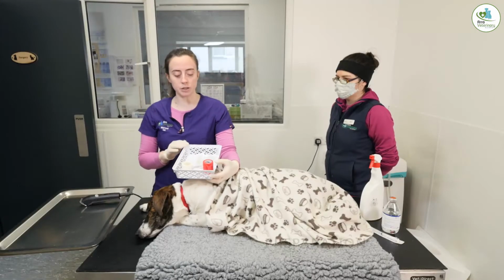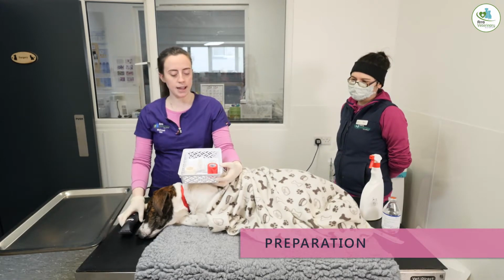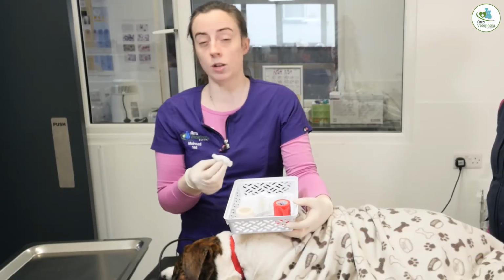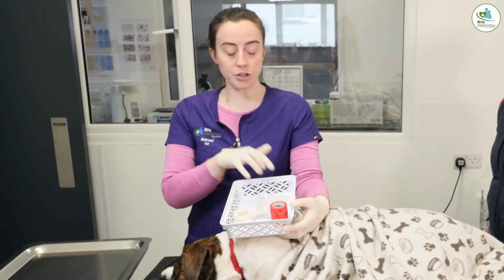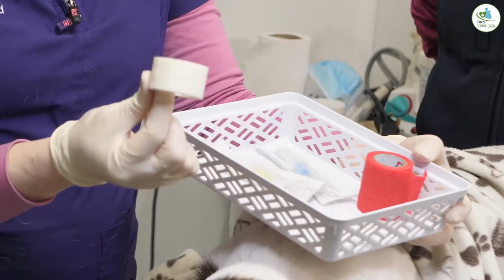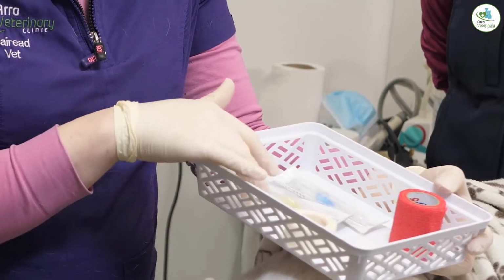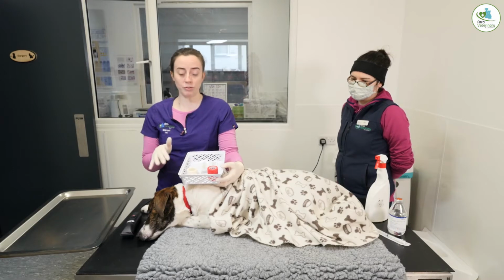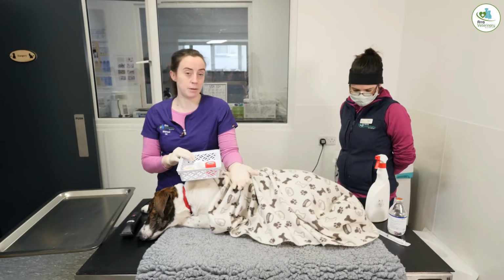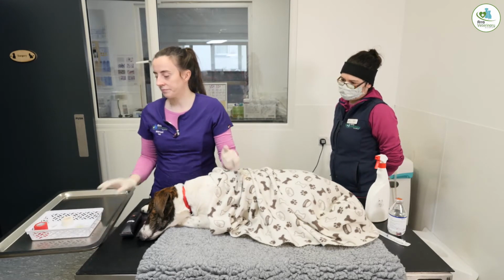So first step that we do is we prepare everything that we need. So clippers to clip the leg, then we have cotton wool here with some surgical spirits on it to clean the area. This also helps dilate the blood vessel as well, which helps put it in. We have two different size cannulas. We have tape then to tape it in, and we also have a bandage. The other thing that's quite handy, and we don't have it in here at the minute, is Emla cream to numb the skin while you're putting it in. Covey's already asleep and he's already had painkillers, so we don't need to apply this cream at the minute. So that's everything that you need.